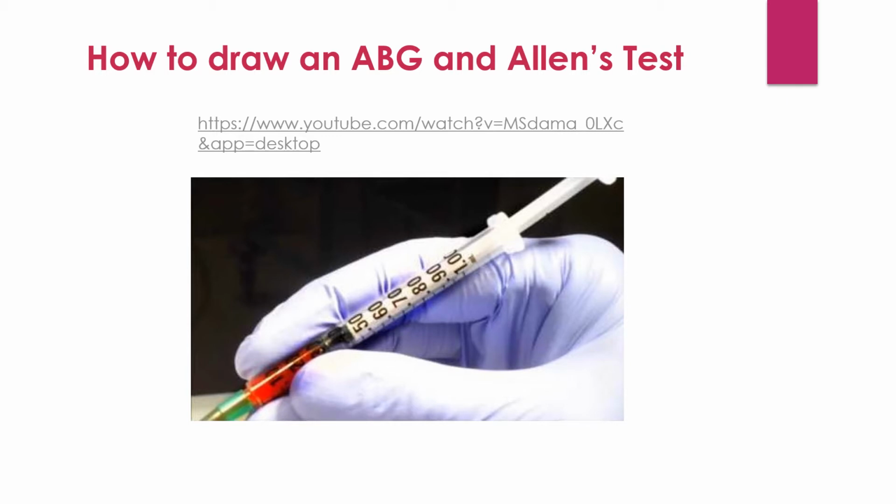The Allen's test is done to determine if the hand has additional arterial blood supply in case during the ABG the artery clots or is being used, to ensure that the whole hand has enough blood supply during the test. So that's why you do the Allen's test, and then it shows you all the steps to draw an ABG.